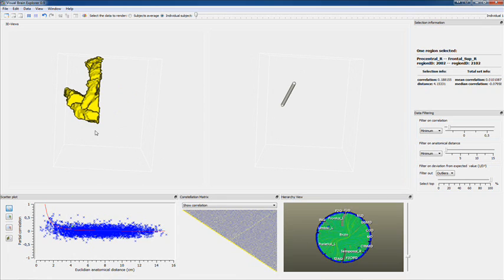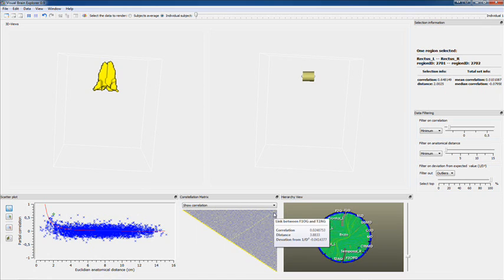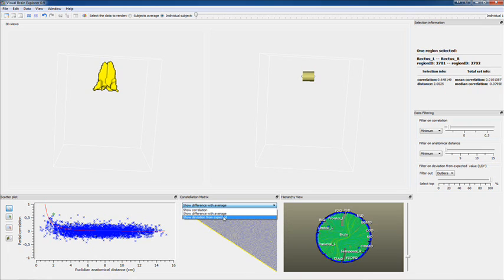This is left, right, left, right. These are the symmetrical regions which are shown here. That's why the symmetrical regions have a high correlation. That's why you see the yellow line here.